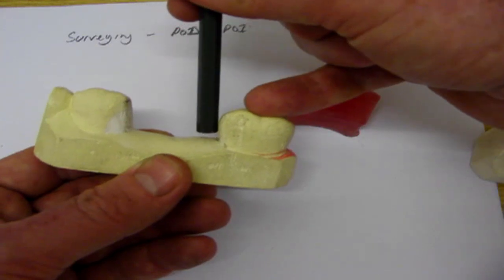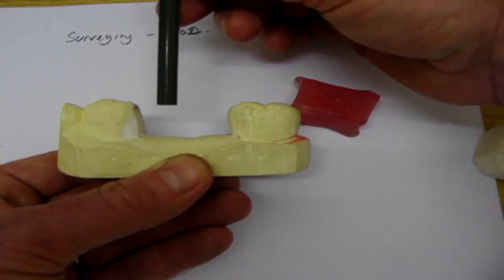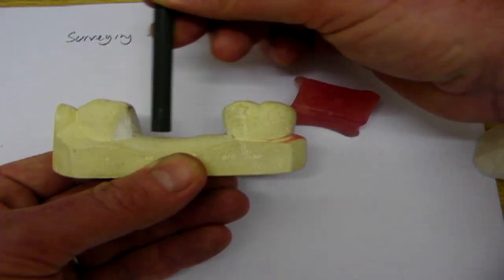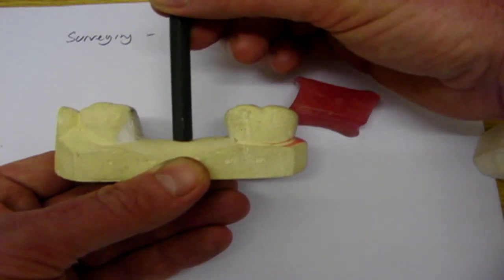On the surveyor, you would put this model on horizontally, the surveyor arm comes down, and you look for your undercut, and there's undercut on both sides. You see this one's already been blocked out, but this is relative to the path of displacement.